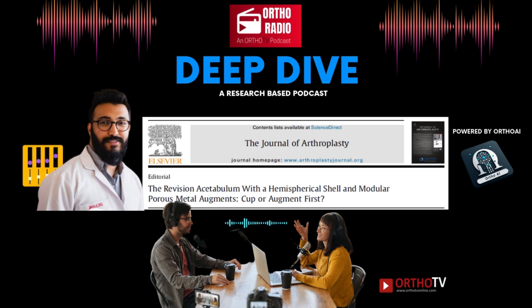The second function is intracavitary reduction. This is important when there's limited space in the acetabulum. If you try to put a big cup into a small space, you're going to have to remove more bone, and you don't want to remove healthy bone if you don't have to. So placing an augment first can actually help reduce the size of the cup needed. So it's like a space-saving technique. Pretty much. So we've got stability, we've got reduction. What's the third function?